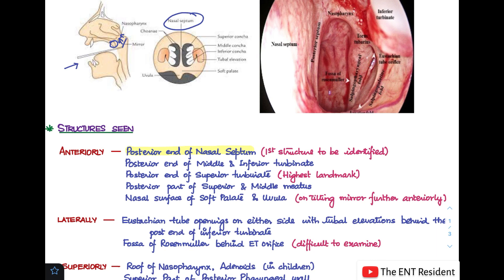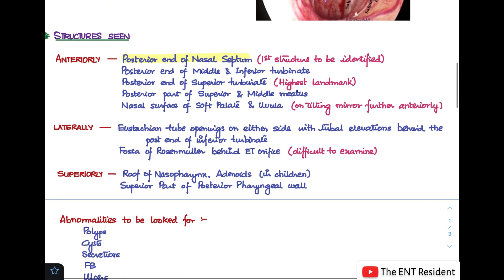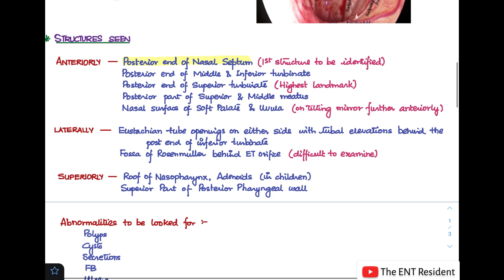The superior turbinate is the highest landmark, and you may or may not be able to see it while doing a posterior rhinoscopy. Other than this, you may also see the posterior part of the superior and middle meati, and the nasal surface of the soft palate and uvula if you tilt the mirror slightly anteriorly.